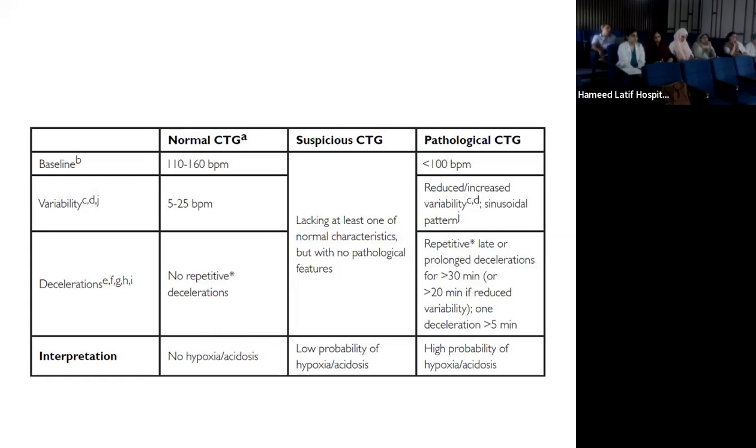And how do you do a fetal blood sample? Has anybody ever seen a video? It's not the easiest thing to do. So someone just told us, it's quite intimidating to do at that time, particularly when the woman has not had an epidural. Even with an epidural, you are basically putting a small sort of probe-like thing or something.